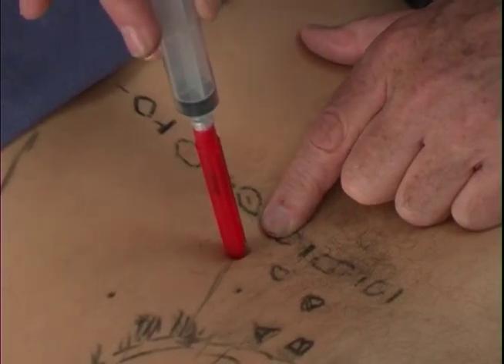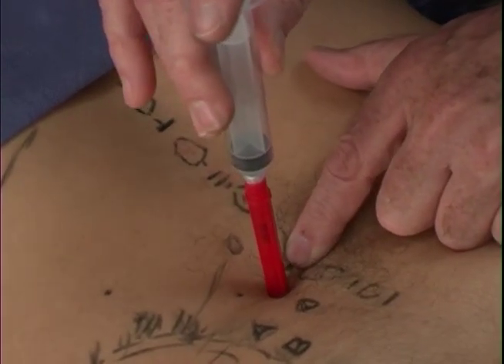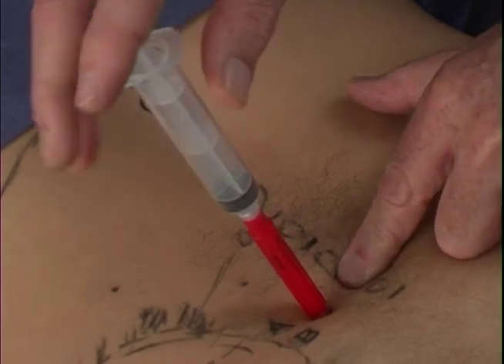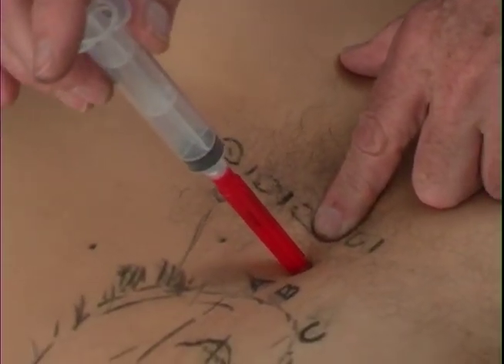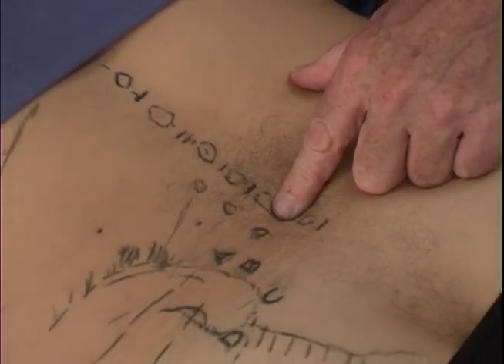This is an injection of approximately a cc in each facet area. Again, remembering that we're not entering the facet here, but we're entering the area of the facet so our solution flows into that tissue.